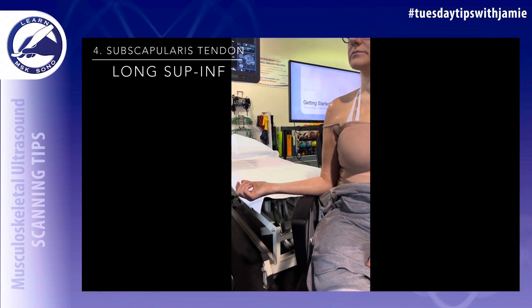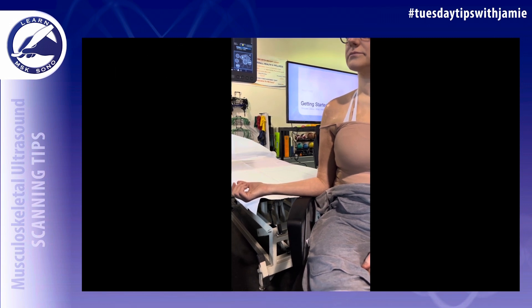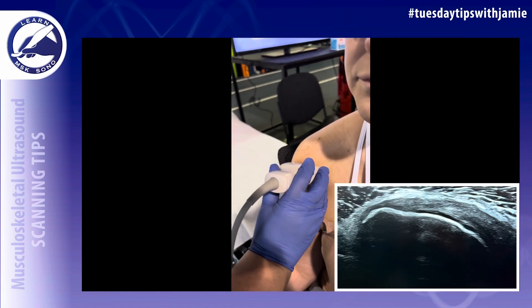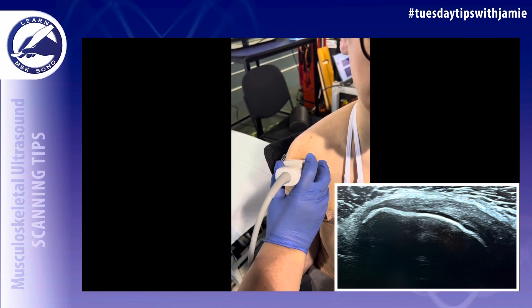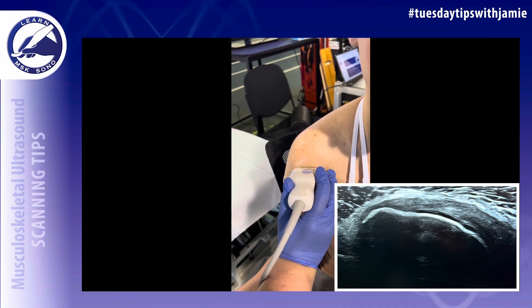Have the arm in external rotation with the elbow tucked in. Place the transducer in a transverse plane over the body to image the subscapularis tendon in the long axis from superior to inferior, sweeping inferiorly while toggling the probe up to eliminate anisotropy.